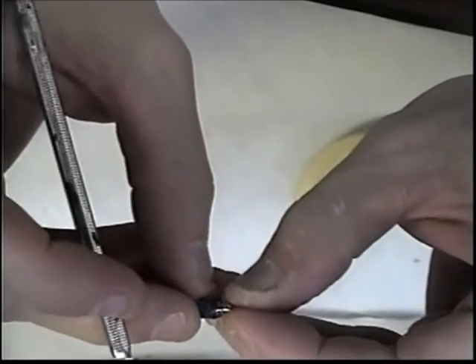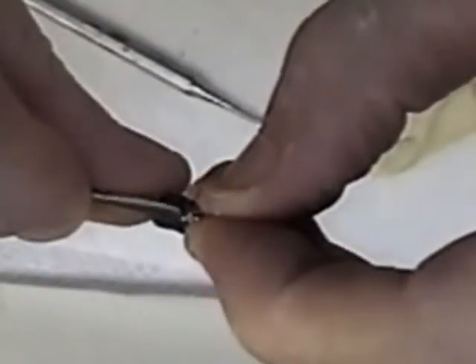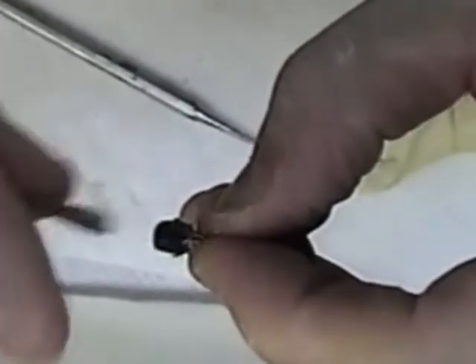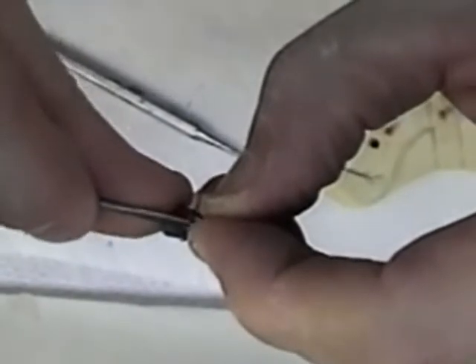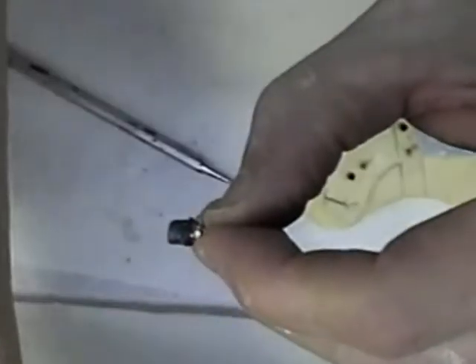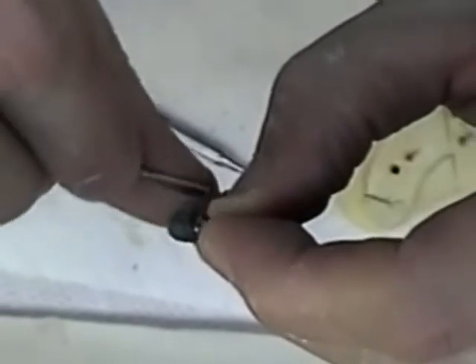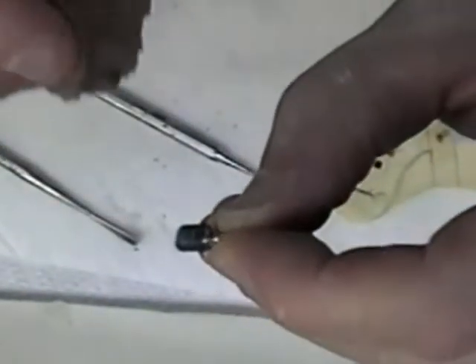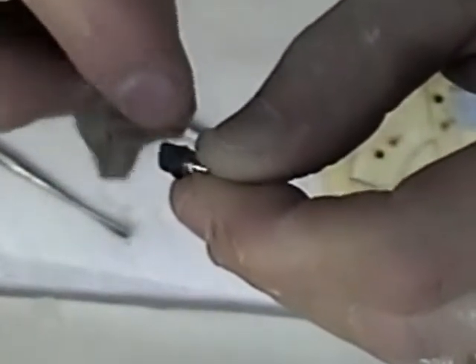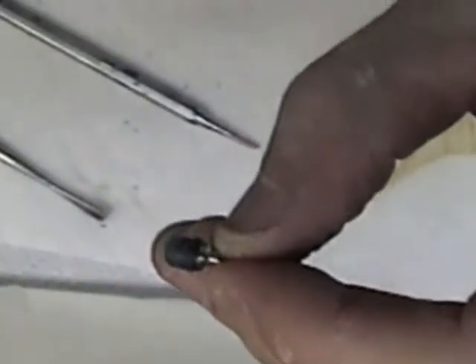I'm going to go ahead and put it in place. Some places here I've put a little bit too much wax. Now what I'm also doing is carving this back to the implant base or platform here. I've filled in any voids, and it's flush to the base or the platform.